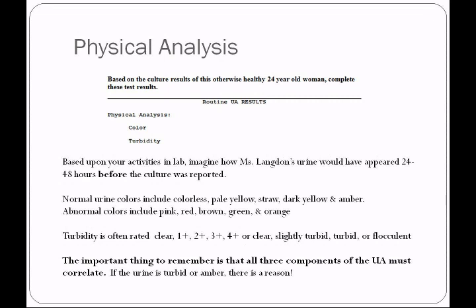So let's take a look at Ms. Langdon's results and think about what the lab might have seen in her complete urinalysis. Based upon your activities in lab, imagine 24 to 48 hours before the culture was reported. What would her urine look like? Does she have a urinary tract infection?